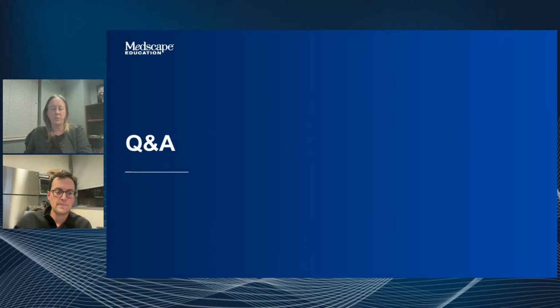I don't use methylene blue now. And I think we don't have to worry about that with indigo carmine. I'll be honest, there are sometimes in the case where you can't remember, and you can pause and look up whether they're on an SSRI, or just use indigo carmine.